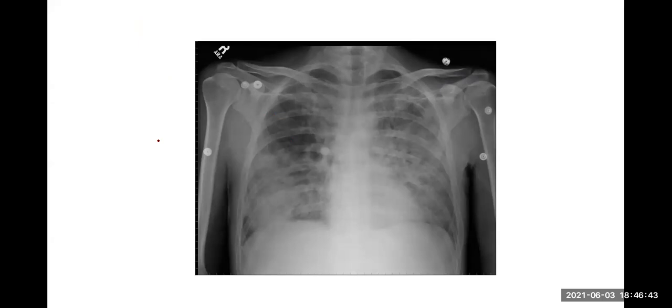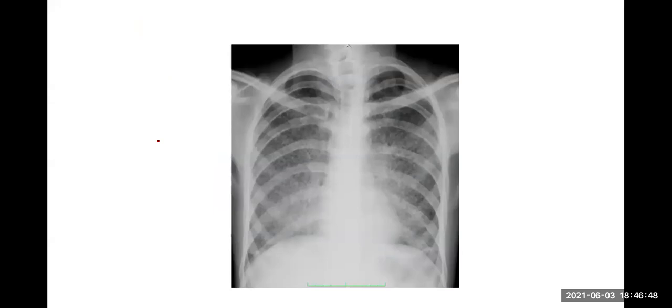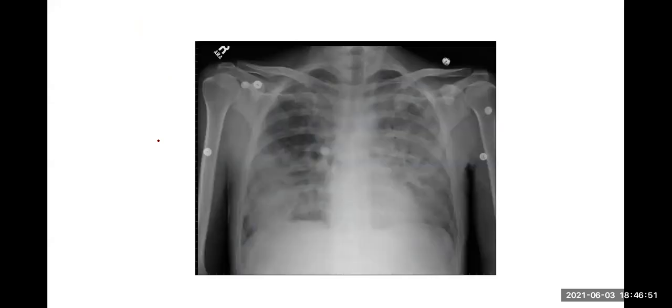Right, now let's look at this. Right. මේ X-ray එක දිහා බැලුවම ඔයගොල්ලන්ට තේරෙනවා patchy sort of whitish stuff everywhere නේද? Patchy whitish stuff everywhere. There are 3 or 4 differential diagnoses of this appearance. දැන් අපි ඒ ටික බලමු. X-ray වල ගොඩක් වෙලාවට differential diagnosis දෙන්නත් පුළුවන් තමයි. මේ වගේ මේ හැමතැනම සුදු ටිකක් patches වගේ තියෙන X-ray වල දැකලා තියෙන්නේ. So what are these?